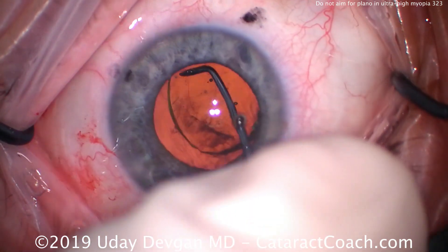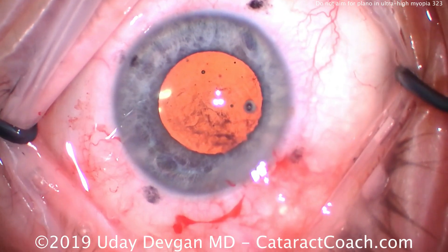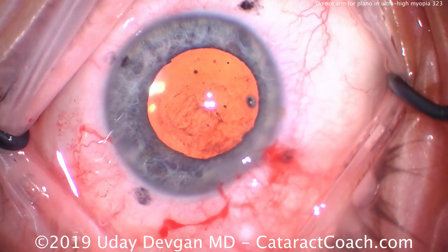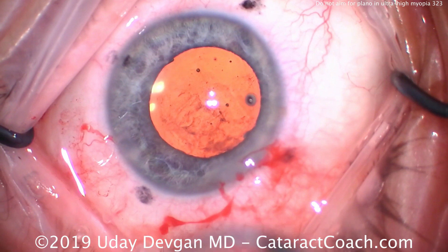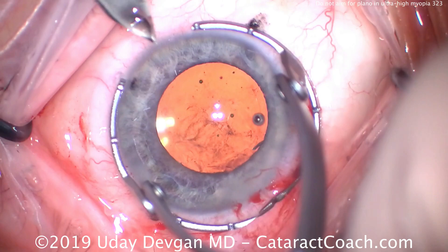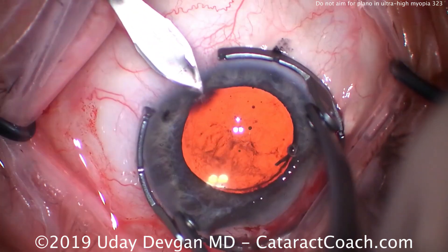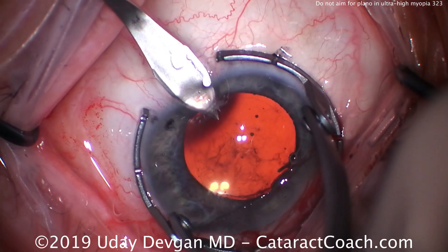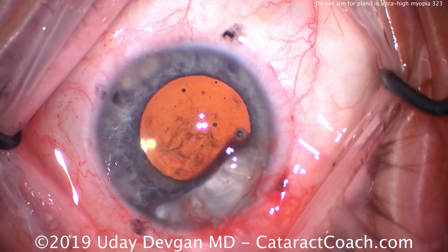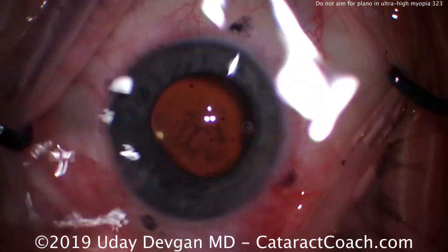There's the IOL dialed in the capsular bag — that looks great. We can see nice centration and good overlap of the capsulorhexis. Given the variability in lens calculations, even using the most modern methods, there will be some variable outcomes. Here we're making a paired incision still at the 75 degree steep axis, opposite the main incision. By having these two paired incisions, we're going to flatten this one meridian by about a diopter, helping the patient achieve a nice spherical outcome.